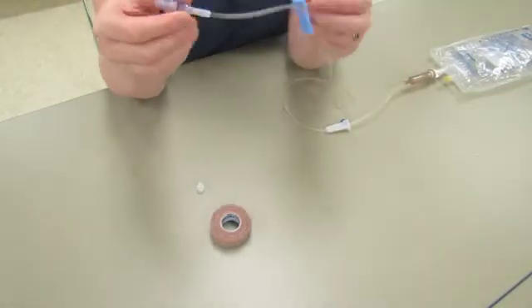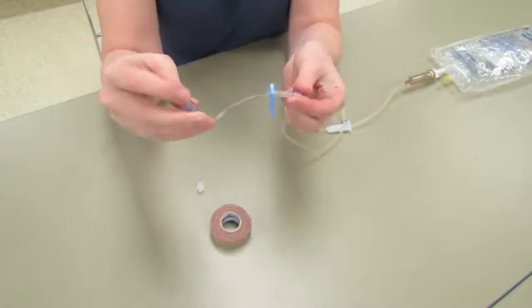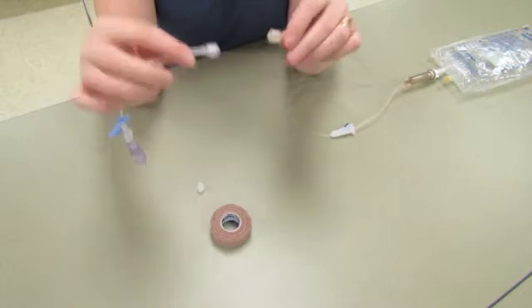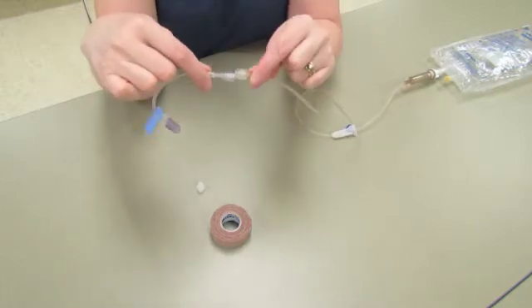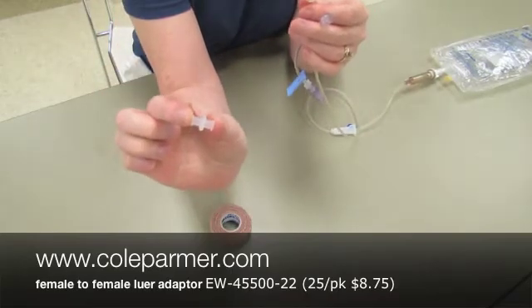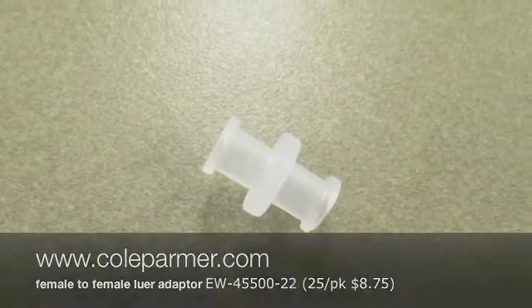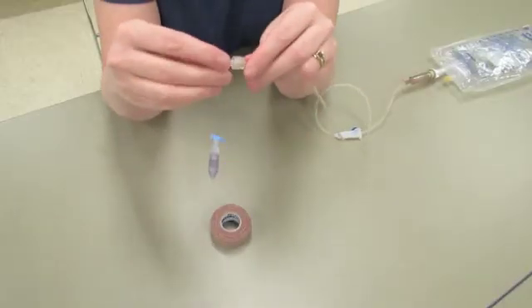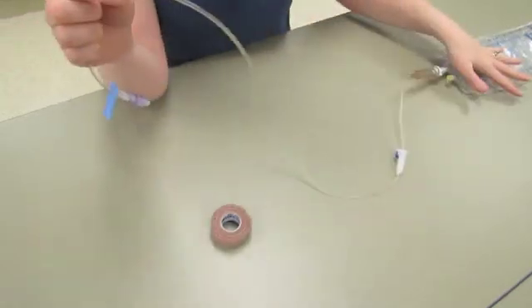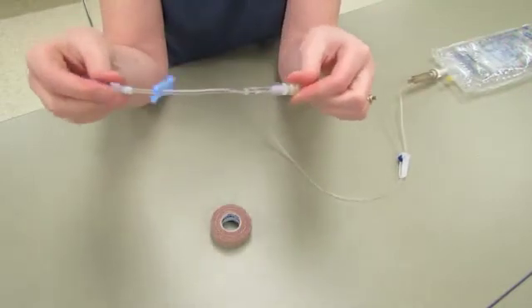And then we also have a typical 6-inch extension tubing with the needleless system cap or whatever type of cap you do. So basically a saline lock. Now, the problem is that these two ends don't stick together. So the solution is this double female luer adapter. So that you just screw on the IV tubing, which is going to go into your drainage bag that you put underneath your pillow, and you screw on the extension tubing.